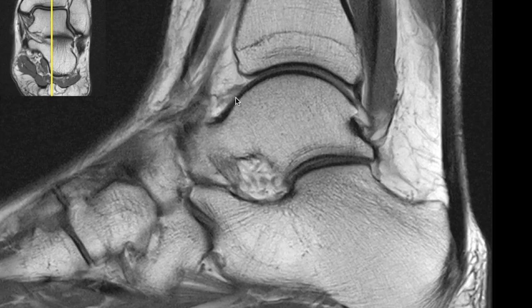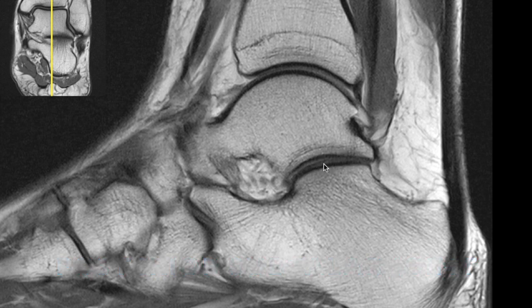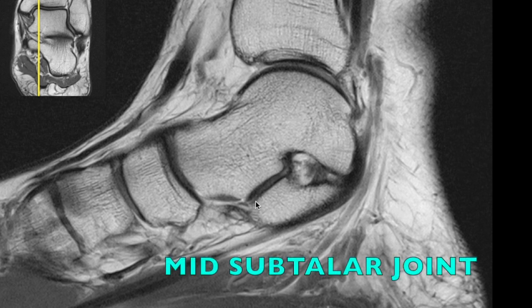Going further towards the midline, you can see the tibia articulating with the talus and the talus articulating with the calcaneum — this is the tibiotalar joint. The gray colored zone is the tibiotalar cartilage. This is the subtalar joint between the talus and calcaneum. The subtalar joint consists of three parts: anterior, mid, and posterior subtalar joint. This is the posterior subtalar joint, and you can very well identify talar and calcaneum cartilage on the proton density images.